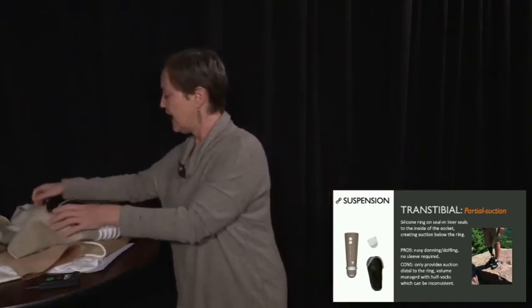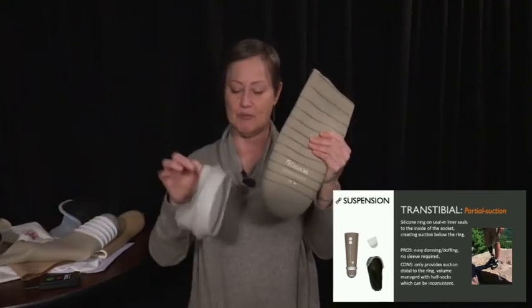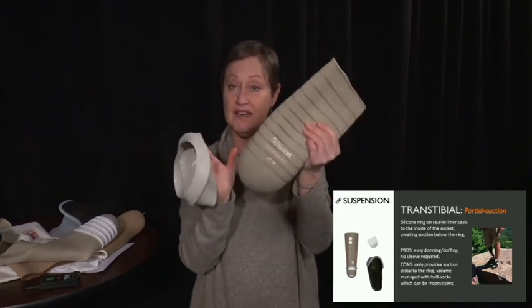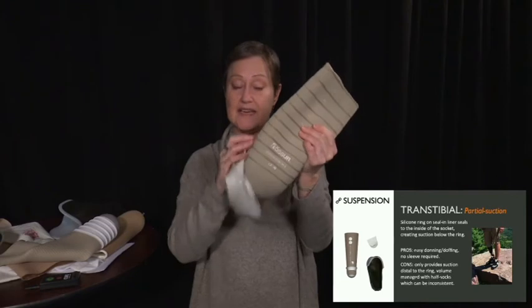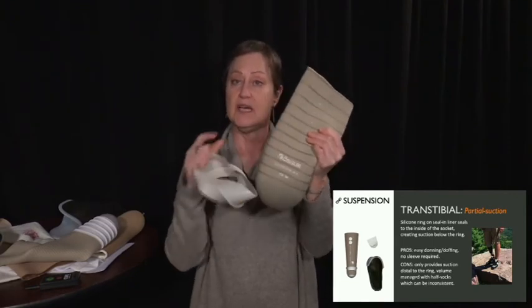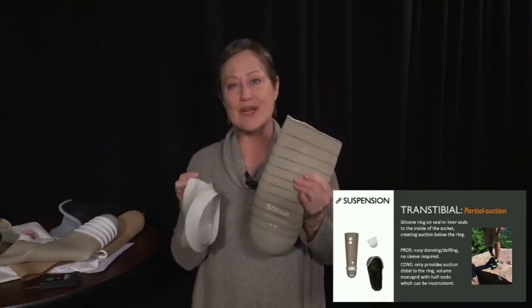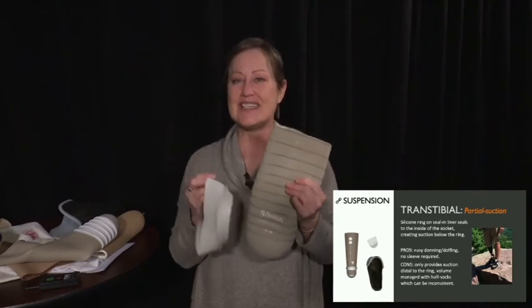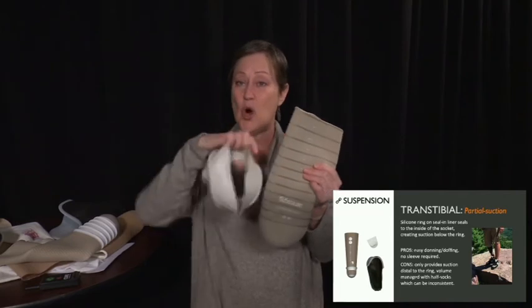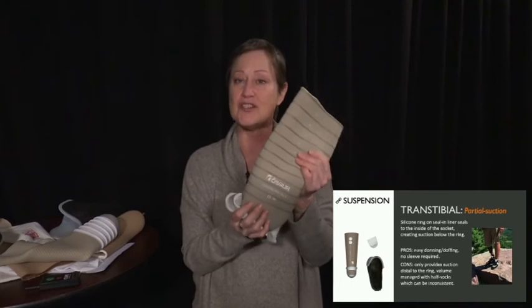You also might have, this is a larger liner, this is for a transfem, but I brought this to show for both. You also might have a separate ring, just one ring that is adjustable on where it is on the leg, on the residual limb, in order to get the most suction. One of the tricky parts, I think, with the partial suction is teaching the patient sock management. The sock can't go over this ring, or it's a wick, it's an air wick, and now you've lost your suction.